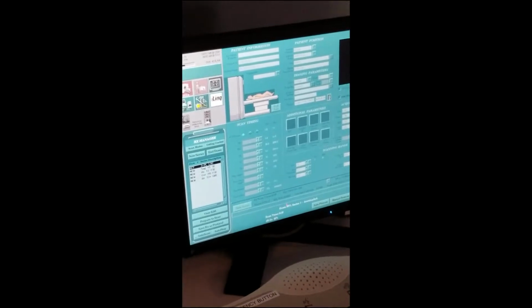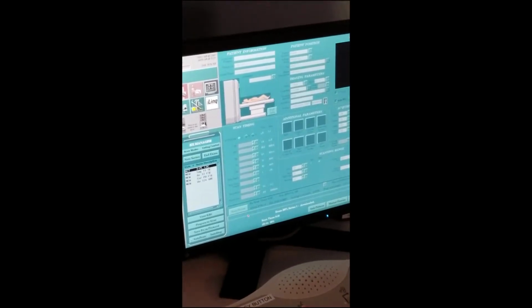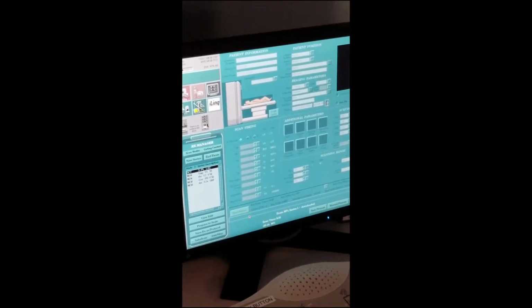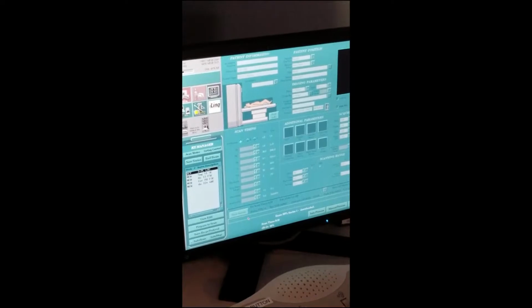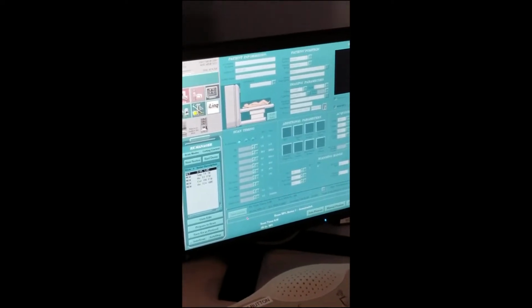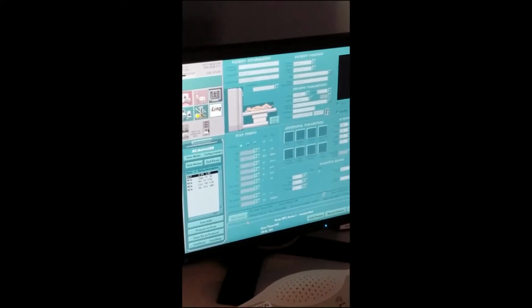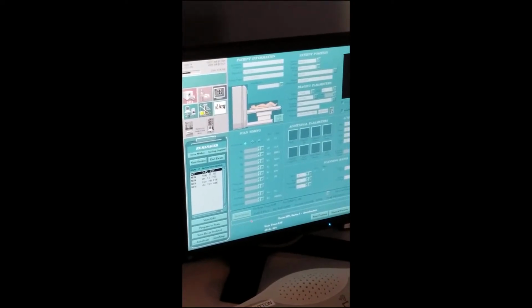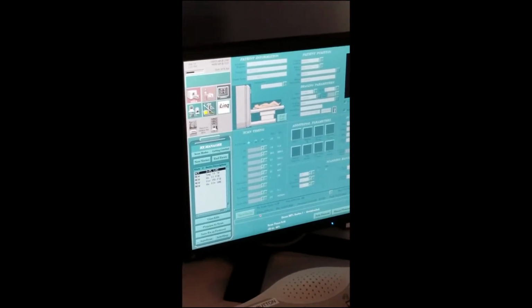And now we communicate with the patient. It's going to be less than a minute because it says 19 seconds. You can say less than a half a minute, and you're going to hear the knocking noise. And here we go, right? Okay, Eric, it's going to be less than a minute. You'll hear the knocking noise. Here we go. Okay. Now I want everybody to listen to the noise.